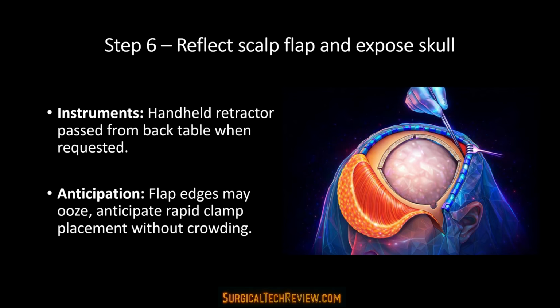Step 6. Reflect the scalp flap. The scalp flap is reflected to expose the skull. Retraction is maintained while monitoring the flap edges for bleeding. Instruments may include handheld retractor passed from the back table when requested. Anticipation: flap edges may ooze. Anticipate rapid clamp placement without crowding.